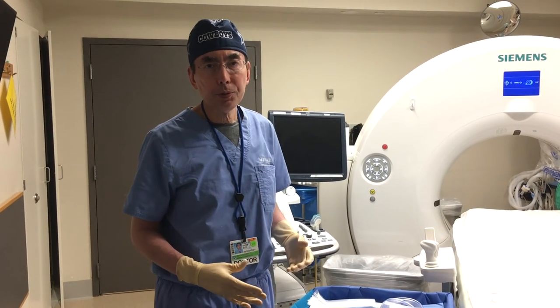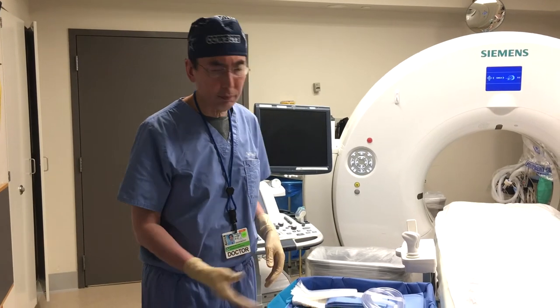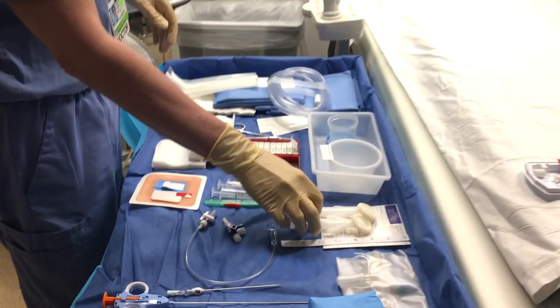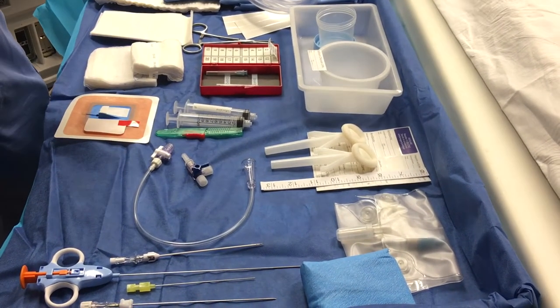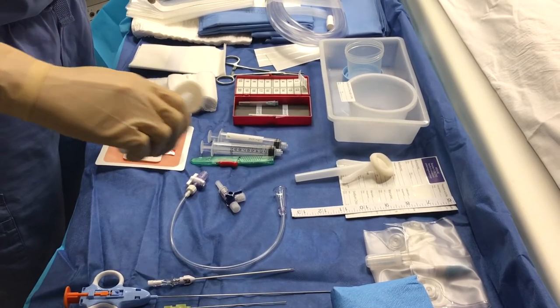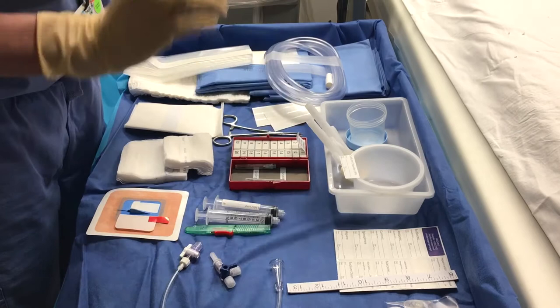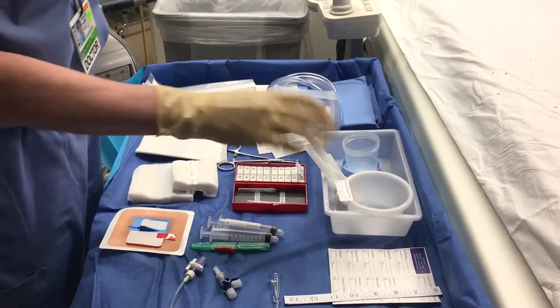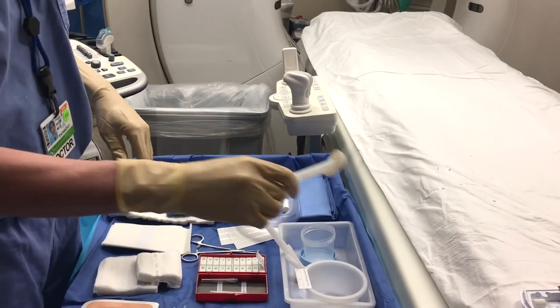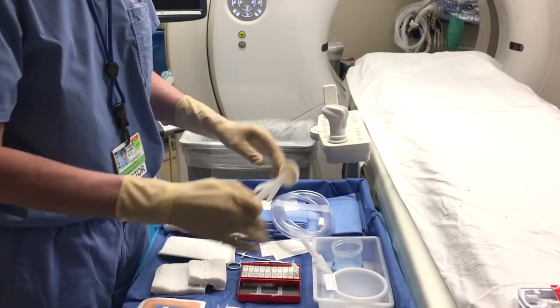Now we'll go through a variety of items you'll find on your sterile tray. Not all of these items will be on your tray every time — it depends on the procedure. One of the first things are the prep sticks. When I come to the sterile table, already gowned, gloved, masked, and capped, I break the seal on the prep sticks so the chlorhexidine and alcohol move down into the brush. One of the first things I do before setting up the rest of the tray is prep the patient's skin so it has a chance to dry — particularly important if using an adhesive drape.